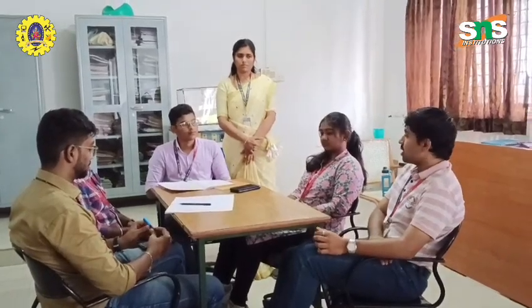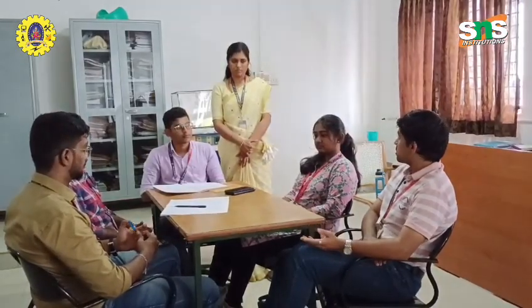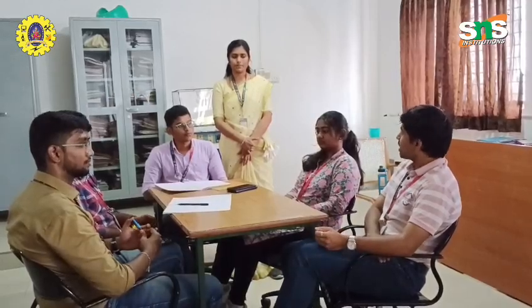But can you explain how this pedobarograph is related to the foot ulcer? So basically the main problem with diabetic patients is foot ulcer, and people with foot ulcer will lose sensation in their foot. So when you identify the high pressure areas with this pedobarograph, you will be able to know if they have sensation or not. If they do not have sensation, it means the ulcer is severe and they have to take immediate treatment.